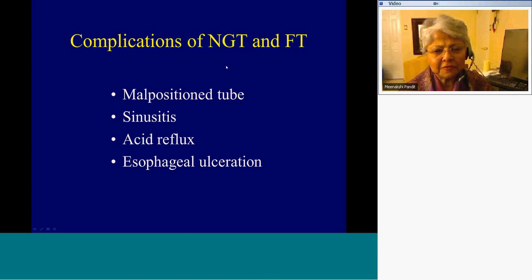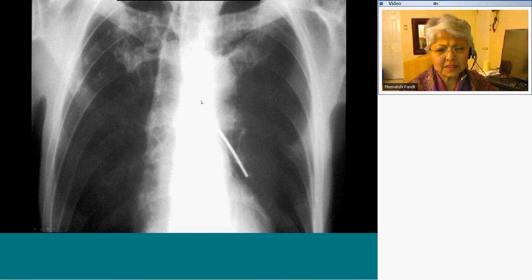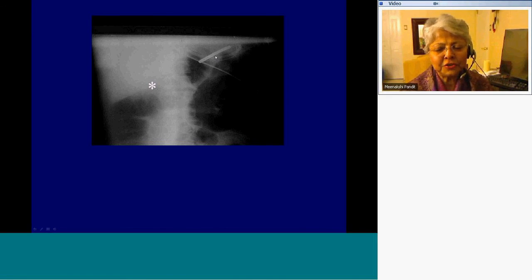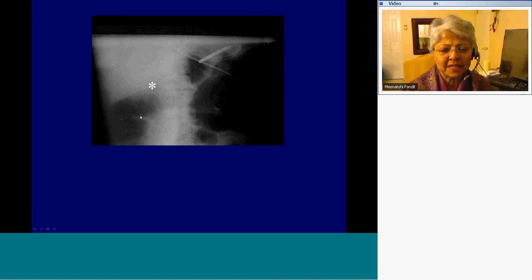Complications of nasogastric and feeding tubes include malpositioned tubes, sinusitis, acid reflux, and esophageal ulceration. This shows a feeding tube extending into the left lower lobe airway. If the tube is in the fundus, it should be past the midline on the side of the patient in the gastric antrum, because that's where you want the feeding to take place — otherwise it will pool in the fundus and cause reflux and related problems.